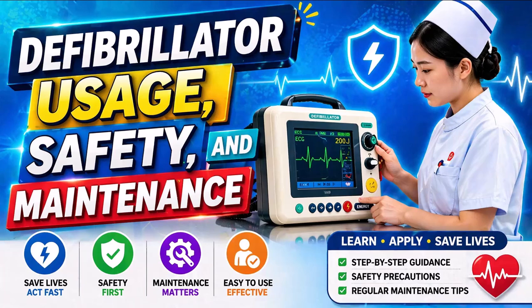The basic working principle of a defibrillator involves delivering a high-energy electrical pulse through the chest wall to the heart. This energy depolarizes a large portion of the heart muscle simultaneously. When the electrical shock stops, the heart's natural conduction system can regain control and generate a coordinated heartbeat.